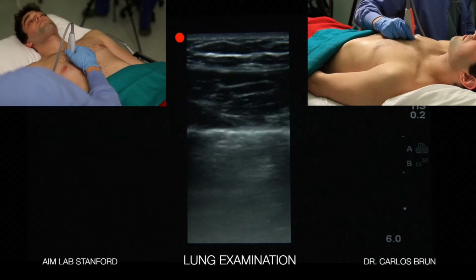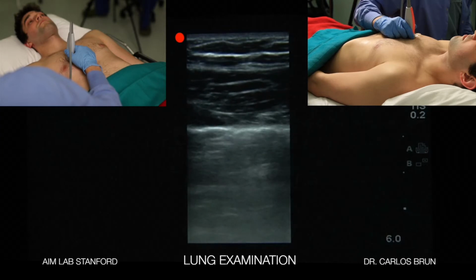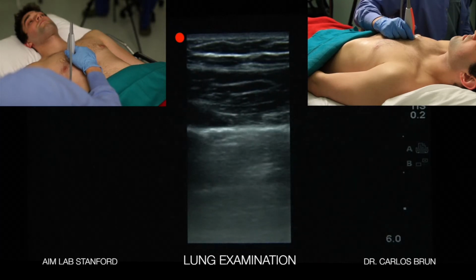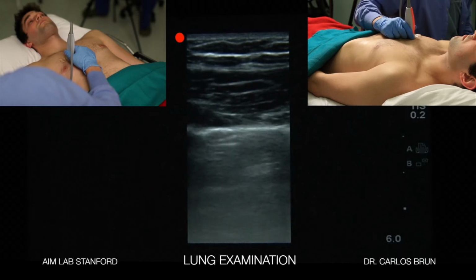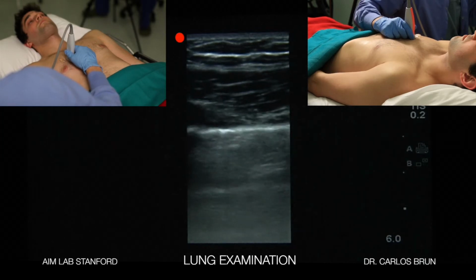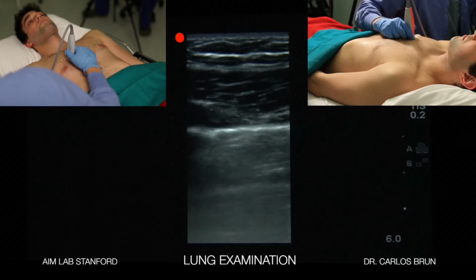of pneumothorax. Remember, this is clinical context, so you need to have a reason for pneumothorax, and you might not want to jump to decompression right away unless your patient is needing mechanical ventilation or is hemodynamically unstable. You need context. Just because you think you see it on ultrasound does not mean you need to put a needle in it. So this is the basics of the pleural ultrasound. One other thing you could potentially do would be to place color on this, but we will discuss that in a future module. Remember that this is a bilateral examination.